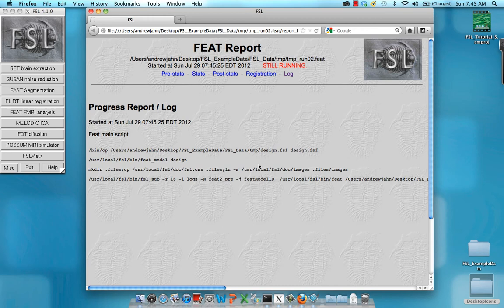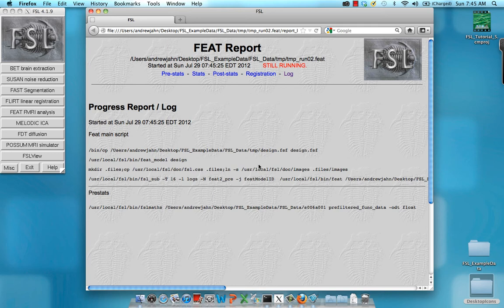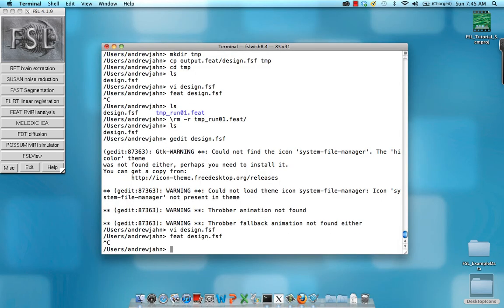So this is very useful because if you have access to a shell scripting program like sed, which comes with all Unix programs, you can use that to set certain variables in each of those fields that I was just talking about. For example, that underscore one that represented run one, you might want to create a generic design dot fsf file, which just has say run number instead of underscore one. And then using a search and replace function from the command line, you can replace that instance and you can go through some sort of for loop. And therefore you can go through every run and do the feat analysis for each one.